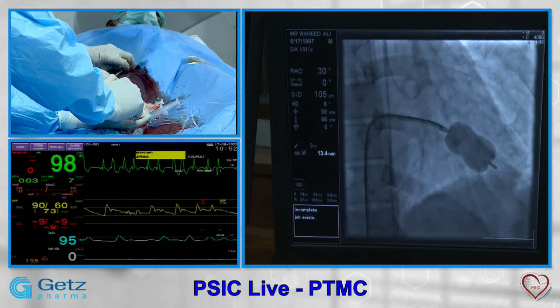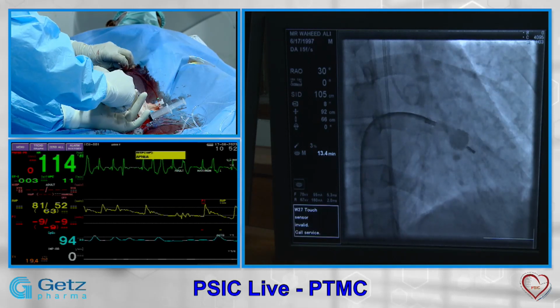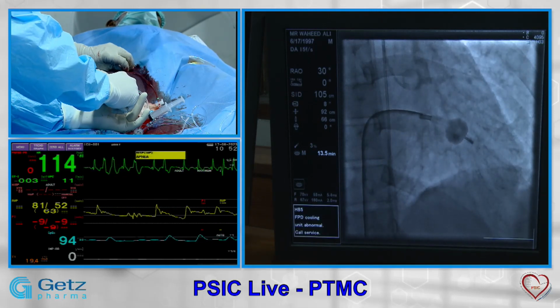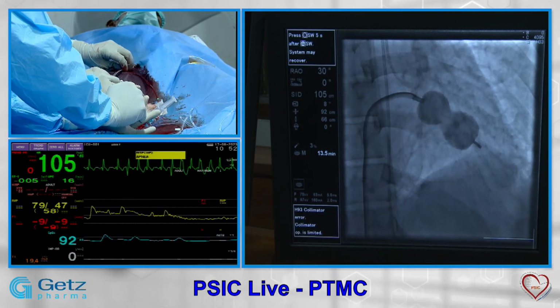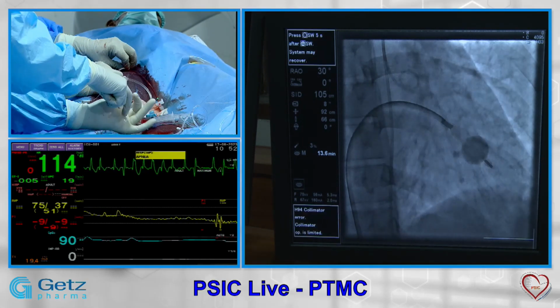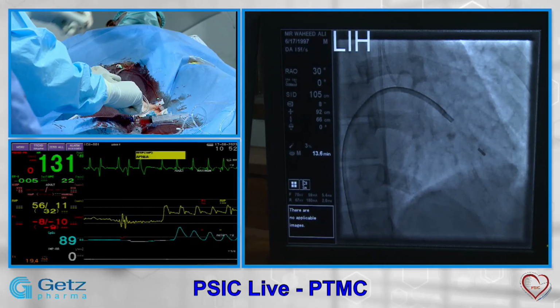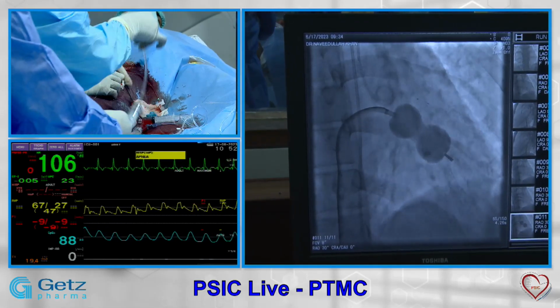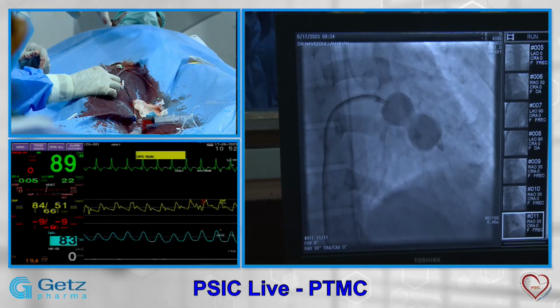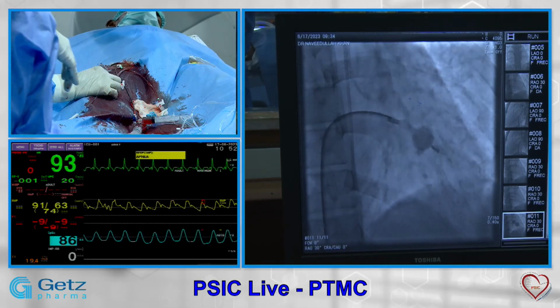Full inflate please. The balloon is slipping down. So I'll inflate, yes, inflate now. This is the waist. Please, down, please. As we know that we have already taken it to a 24 size, the dye is less. That's why it's not giving full pressure. But this will give us some relief because the area was 0.5.